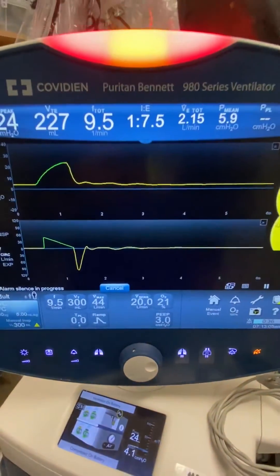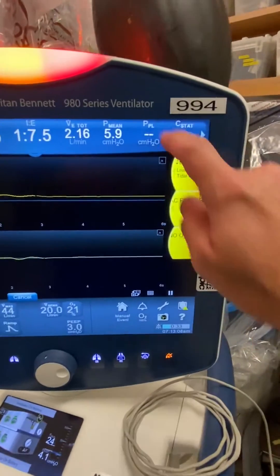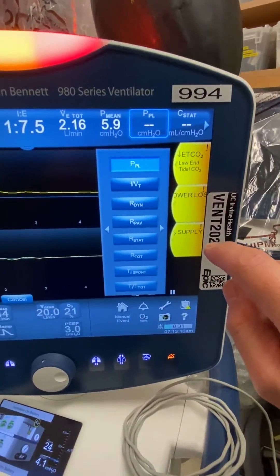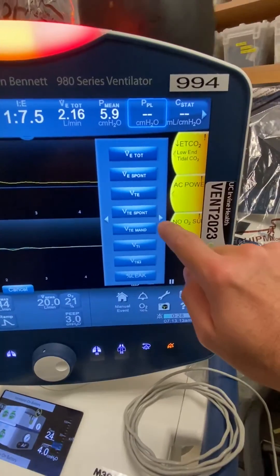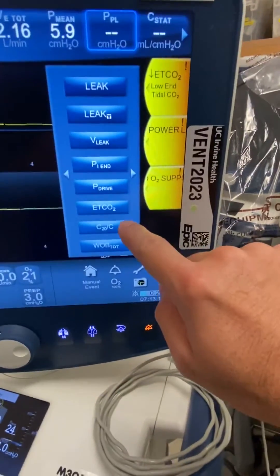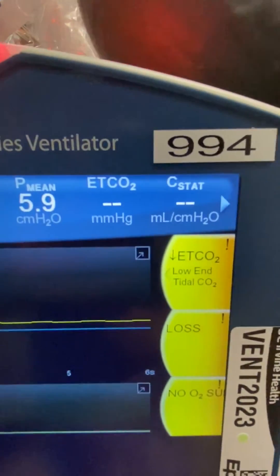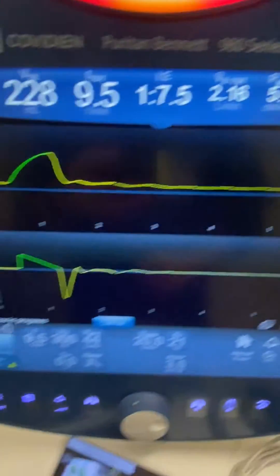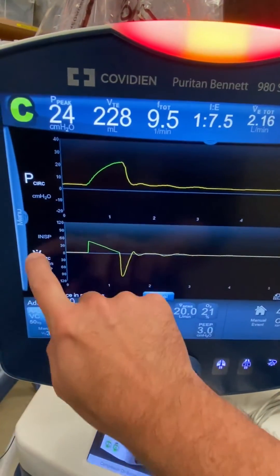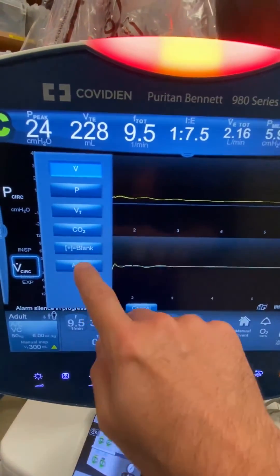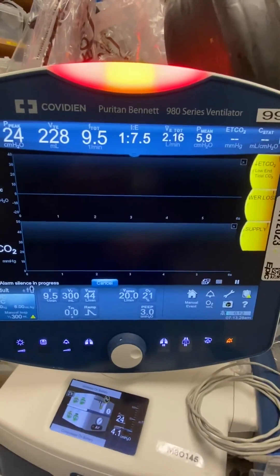Now what if I want to display my capnography waveforms? If I just need the value, I can double tap here, and then I can change what's displayed — all I'm looking for is my end tidal CO2, and that'll display it there as a number. If you want the actual waveform, you can double tap any one of these here, and then change it to your CO2, and then you can get that capnography waveform.